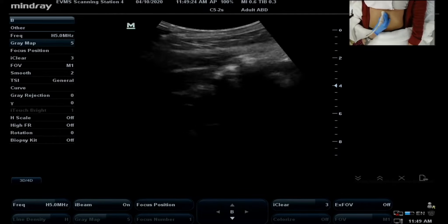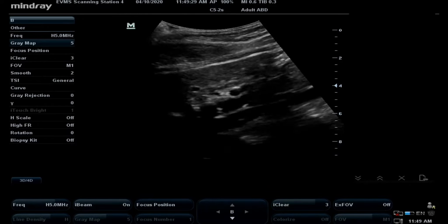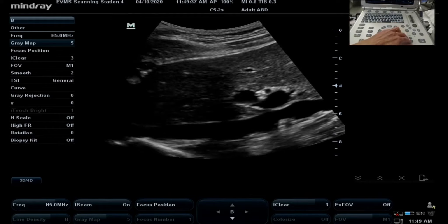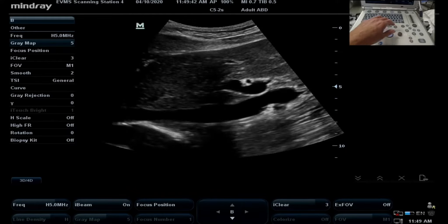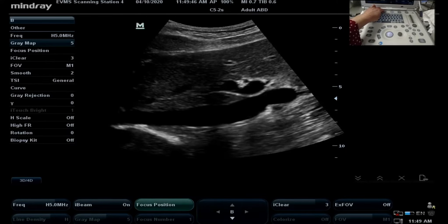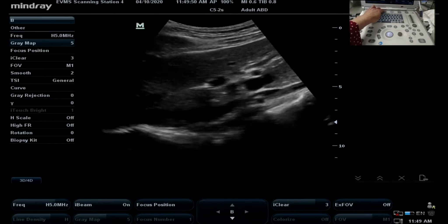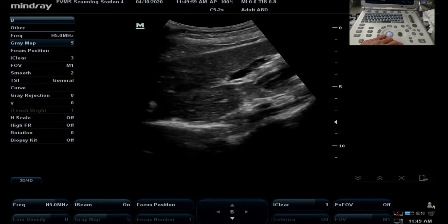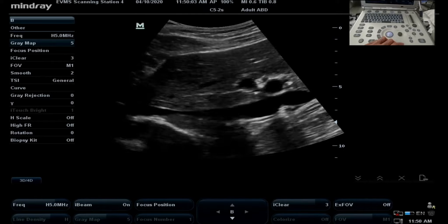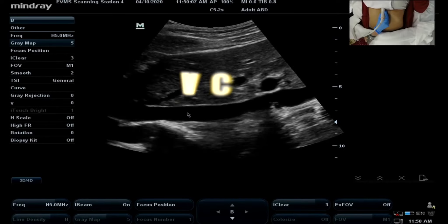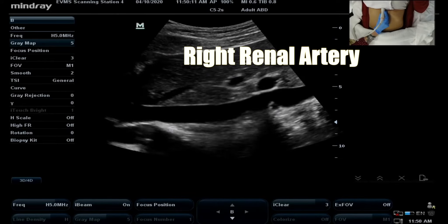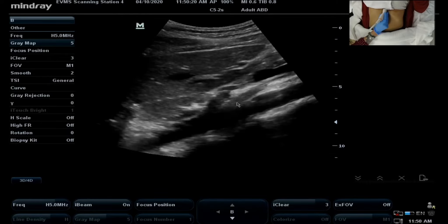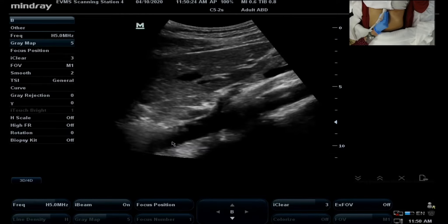As I unfreeze my machine, I'm going to say big breath in and hold it. The first thing I note is I need more depth, so I'm going to increase my depth. The next thing is I'm going to drop my focal zone — focal zone should be deep to the anatomy of interest. Starting very superiorly at sub-xiphoid, rocking to the right I'm looking at IVC, then rocking to the left here we come to aorta — no vessels posterior, anterior branching, and it sits completely posterior to the diaphragm.